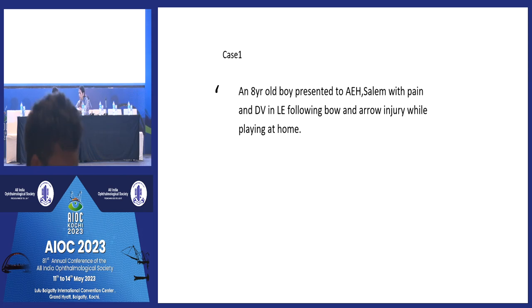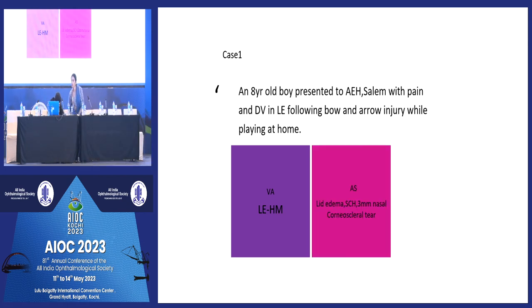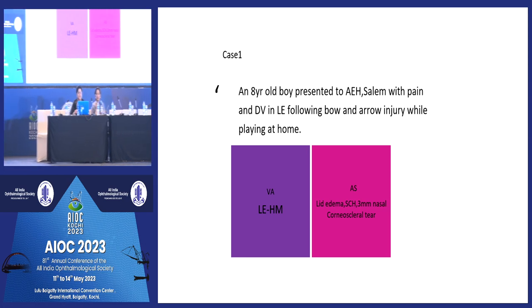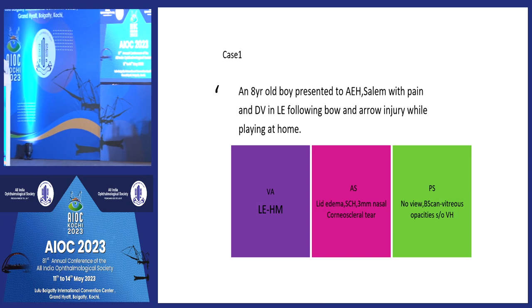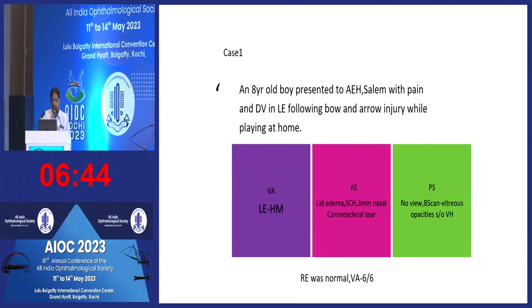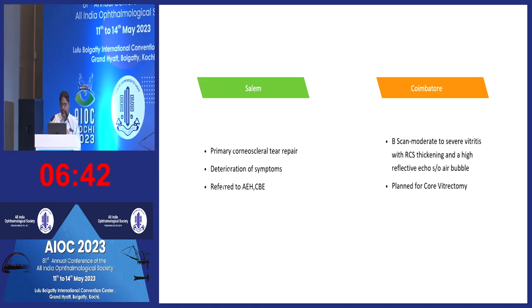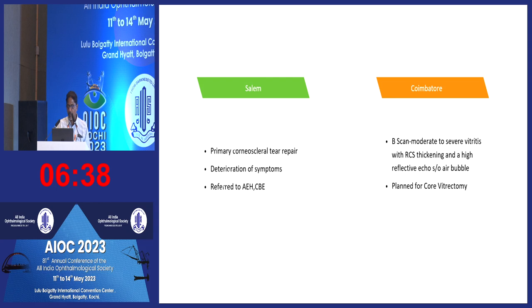This first case was an 8-year-old boy who came to us with a secondary infection following a bow and arrow injury. He had severe vision loss with inflammation in the anterior segment, as well as vitreous exudates. The whole vitreous cavity is filled with severe vitritis and exudates. He had an initial corneoscleral tear repair just next to the limbus, and in spite of the surgery he was deteriorating, and that's why he was referred to our hospital.